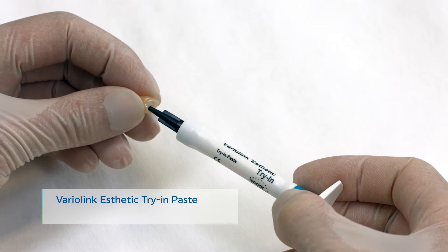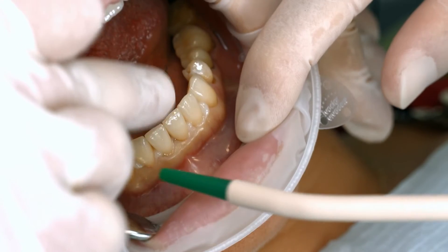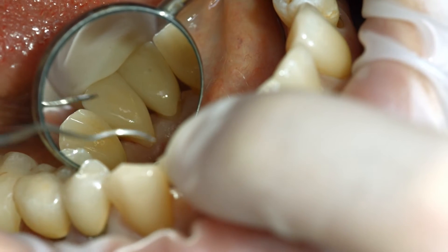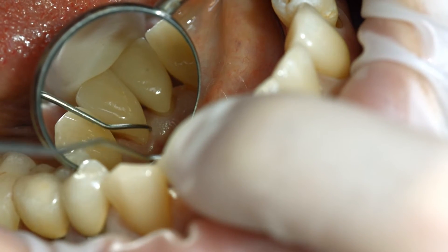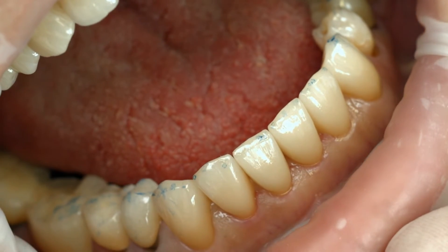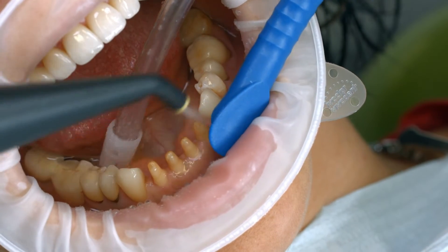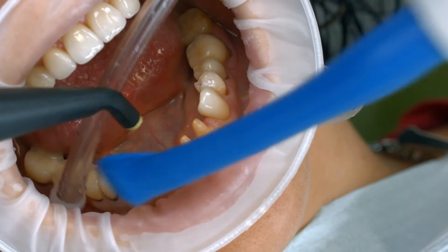For optimum aesthetic results, use Variolink Aesthetic Try-In Paste to evaluate the shade of the restoration. When trying in the permanent restoration, check the shade effect, accuracy of fit, and occlusion of the restoration. Thoroughly rinse off the Try-In Paste with water spray after the try-in and dry the preparation with water and oil-free air.